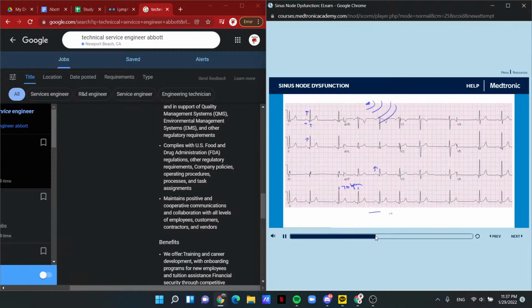This is an example. After just 5 beats, the rate suddenly slows down dramatically to less than 50 beats per minute. These sudden rapid decreases in heart rate are often due to parasympathetic or vagal influences on the sinus node.